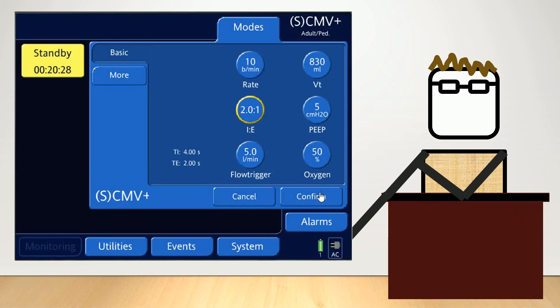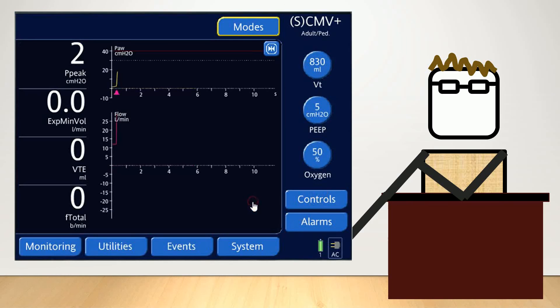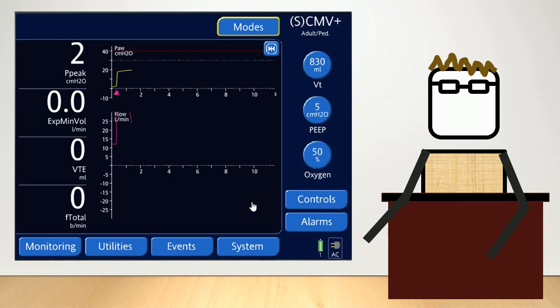After you've done all of those things, you click confirm, and you can start your ventilation — and you're off to the races.